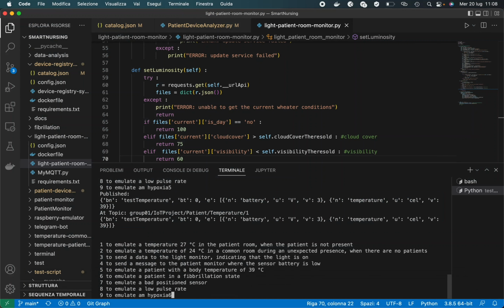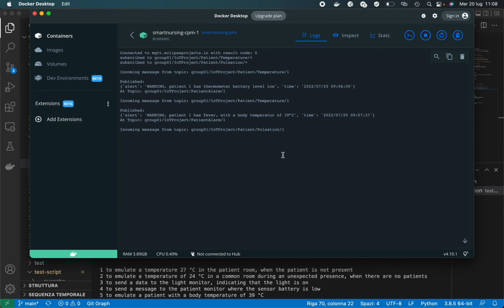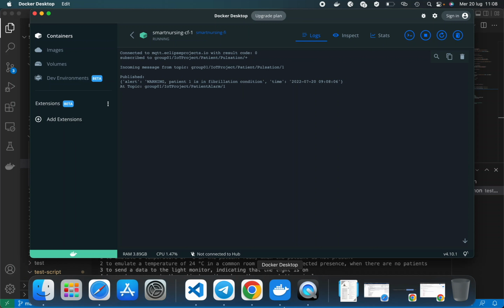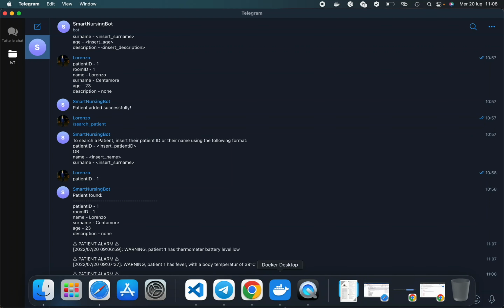Pressing 6, I can start emulating saturation and pulse rate for patient 1. I will send the last 10 samples collected from the sensors. I will emulate a fibrillation state. Fibrillation is computed considering the standard deviation of the good measures collected, and since in our case the standard deviation is higher than a threshold of 5, the nurse will receive a notification of fibrillation.